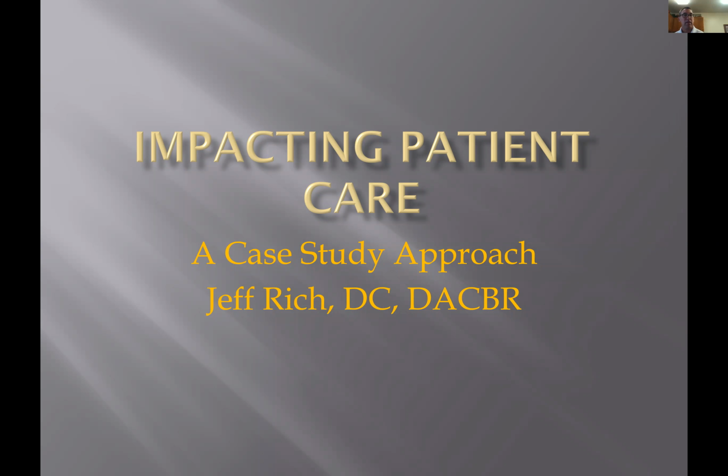Jeff Rich. All right. Well, it's good to be with everybody today and show you some new cases that have come through since the last time we were together, and hopefully it'll be some real practical radiological issues that you see throughout your week in practice. The little quiz that we have for you to take afterwards, it's 6 questions. I don't want that to be hard, so I'll be very clear on some of the things that you'll want to know on that. If you have any questions as we go, just interrupt and keep going. We'll keep going.